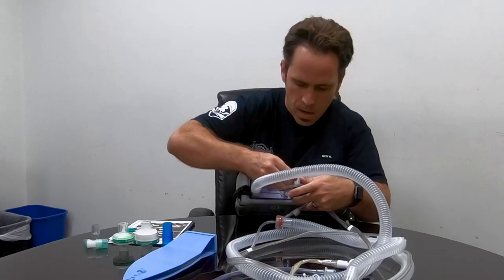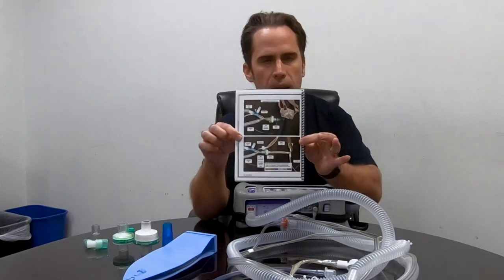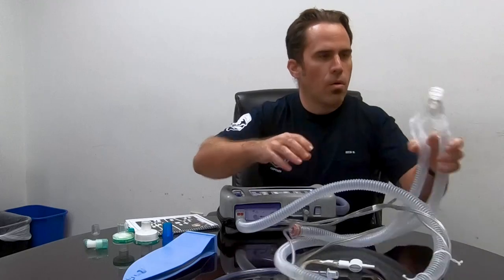What I like to do is flip to my vent book and then just follow along with the picture. Let's talk about everything that's in the pictures and go over that.